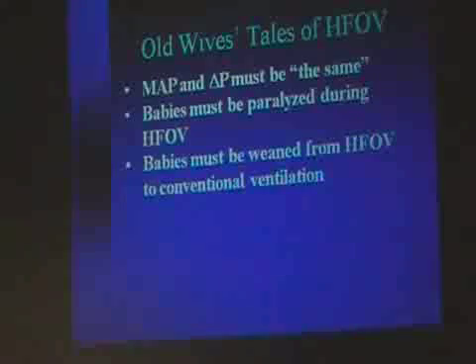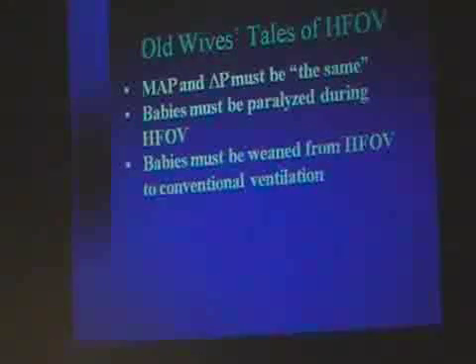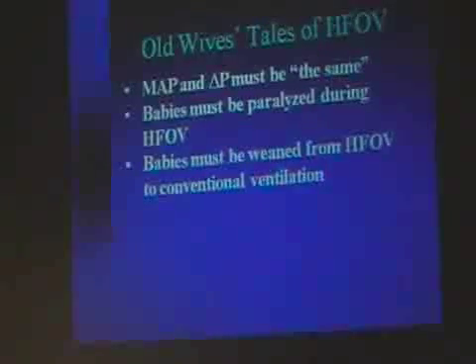So again, we have to look at the big picture. And I've actually just turned the oscillations off, the same way that I've put kids on pressure support, because what are they on if the oscillations are off? CPAP. So if I have any worry that the kid might get apneic and fail, I don't walk away. I sit down, I turn off the oscillations, and I say, are you going to breathe? And if he breathes, then pull the tube. Okay?